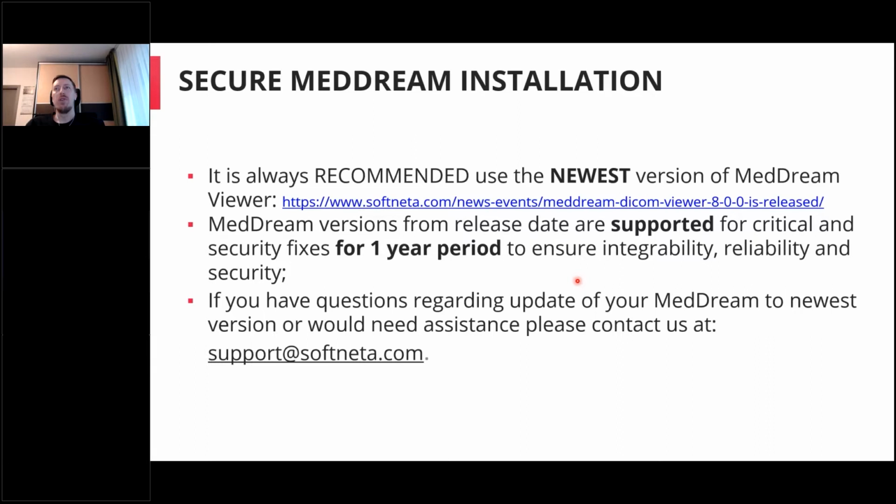To see what's new in the newest version, and of course we encourage you to update if you are still using an older version, because from the release date, critical support and security fixes are supported for a 1 year period, just to ensure integrity, reliability, and security.